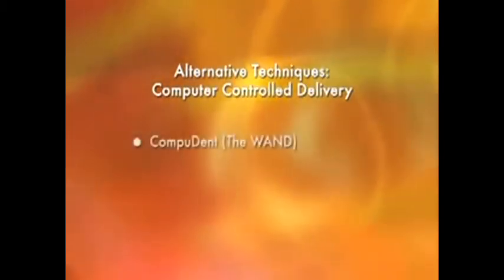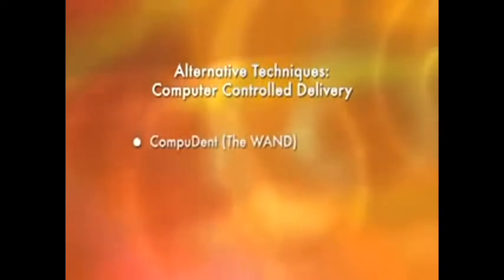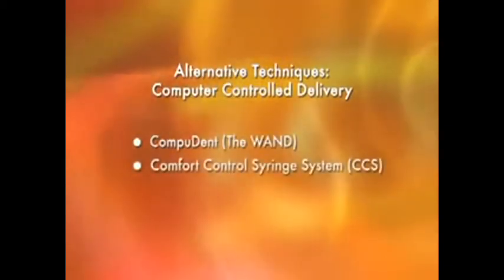There are 2 computer-controlled local anesthetic delivery systems currently available in North America: Compudent, also known as the Wand, and the Comfort Control syringe system. Computer-controlled local anesthetic delivery systems enable the operator to deliver local anesthetic painlessly anywhere in the oral cavity, especially on the palate.